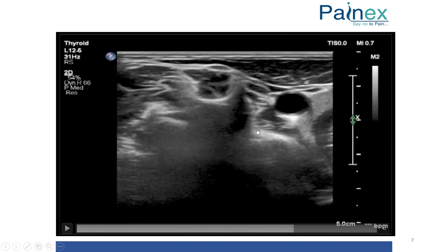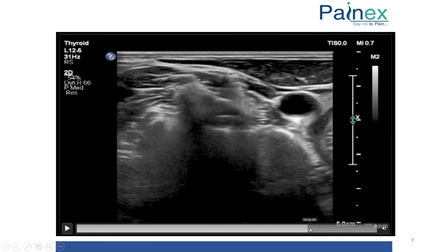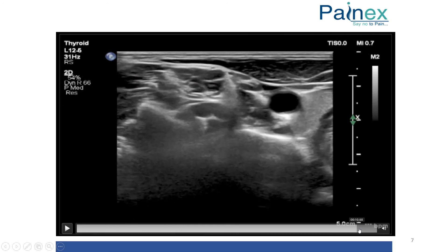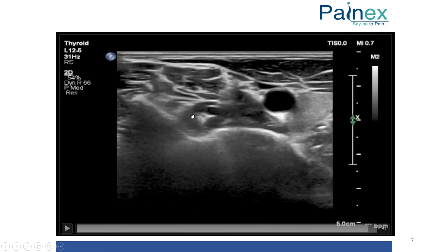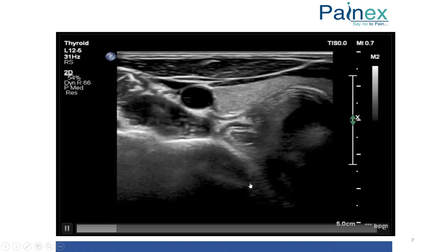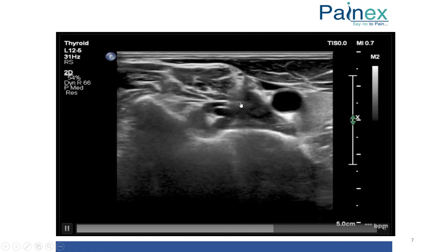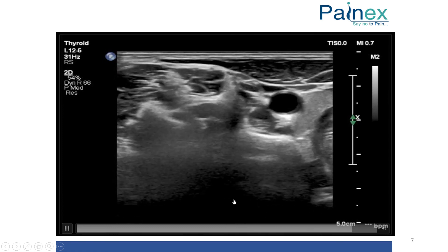At C6 we can see: longus colli muscle, carotid artery, IJV, and the stellate ganglion structure. The phrenic nerve lies just above the longus colli muscle, so the structures can be very compact and that can result in phrenic nerve palsy as well. I will play this video again — at C6 you can see the vertebral vessels disappear as we come up, confirming the C6 level with anterior and posterior tubercle.